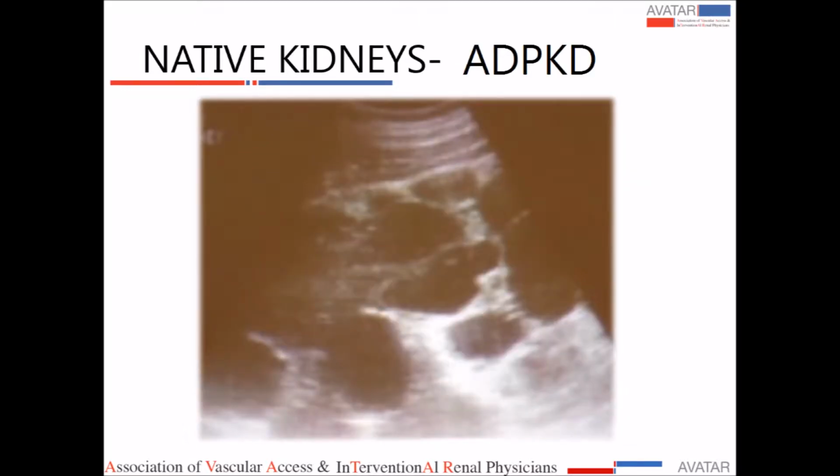And then this is another situation that may mimic hydronephrosis to the inexperienced person, but this is actually multiple cysts that we see in autosomal dominant PKD. Most of my patients with PKD, we are a referral center for PKD, have kidneys that are 25 to 30 centimeters long, going down almost into the pelvis, and all they have is multiple large cysts and almost no visible cortex.